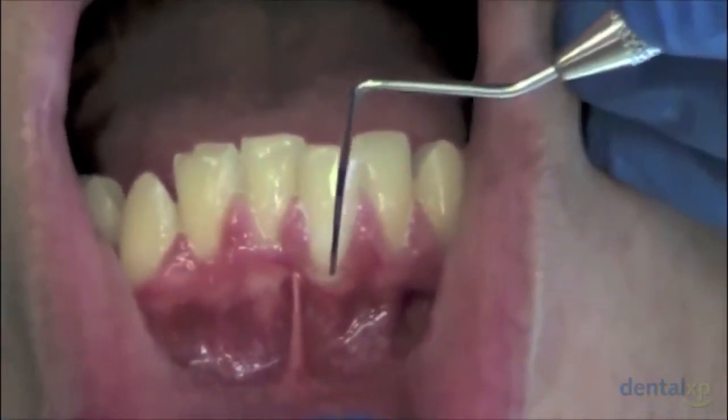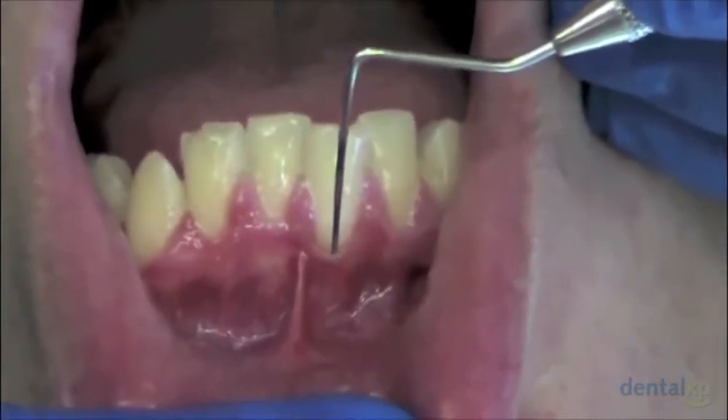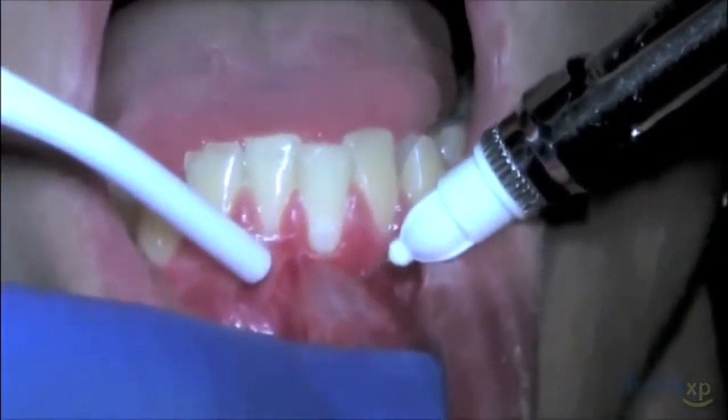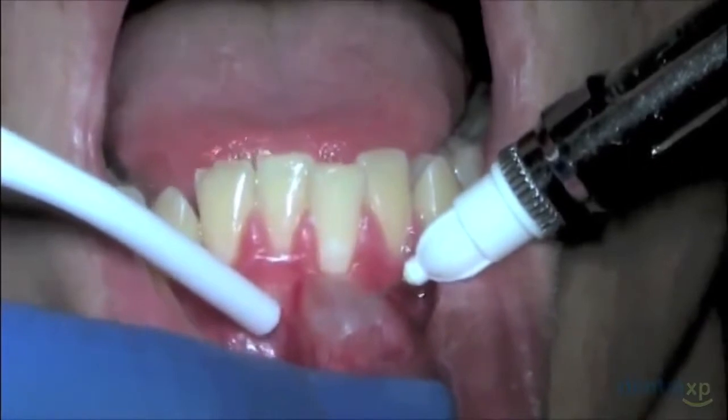The area that we're treating today is teeth numbers 24 and 25, the lower central incisors. The reason that we're treating this area is because of how thin the keratinized and attached tissue is on the facial of number 24, which has begun the early stages of gingival recession.